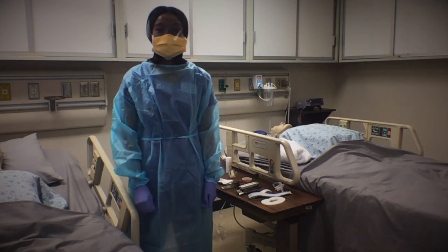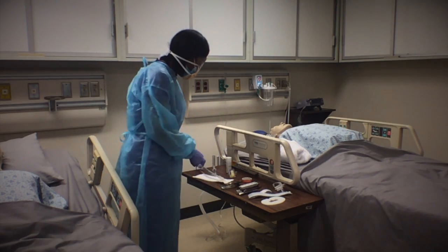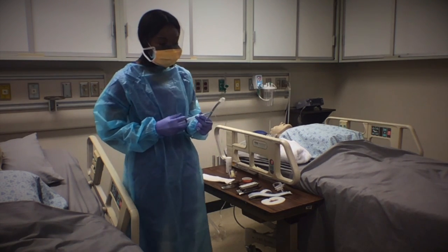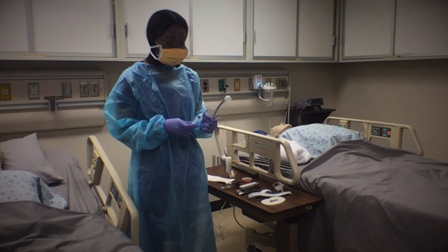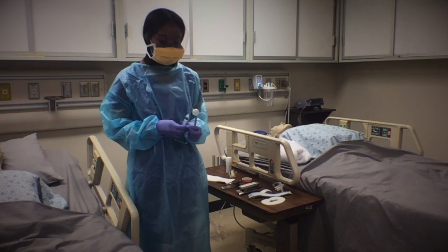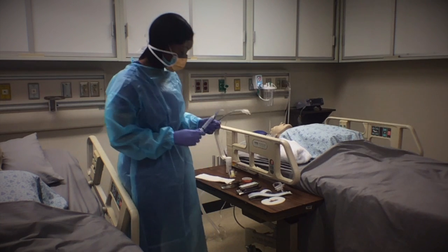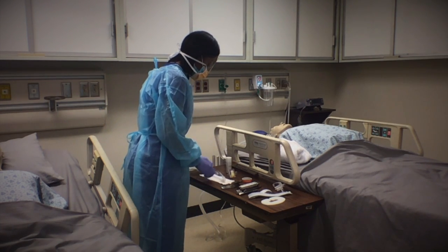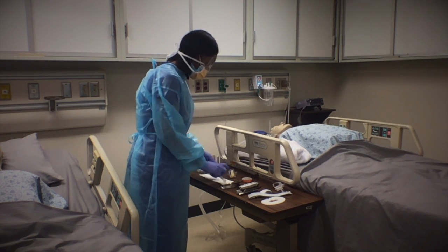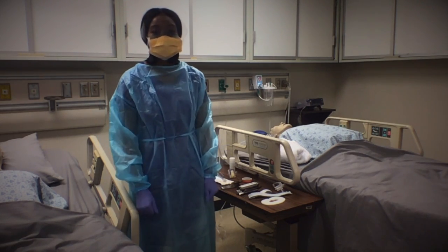I am going to begin with checking the integrity of my cuff, and I'm going to check the integrity by inflating the cuff. I put 6 milliliters of air into the cuff to check the integrity. I'm now going to lubricate the distal end of the ET tube. The distal end of the ET tube is now lubricated.